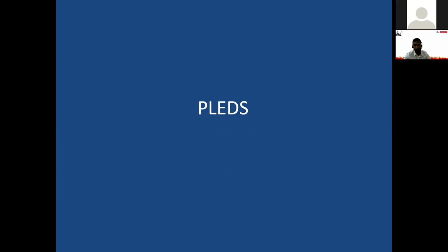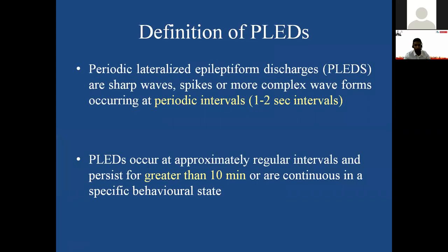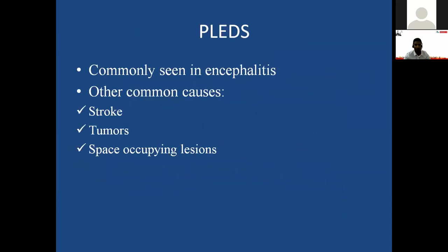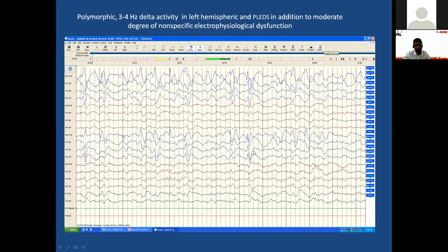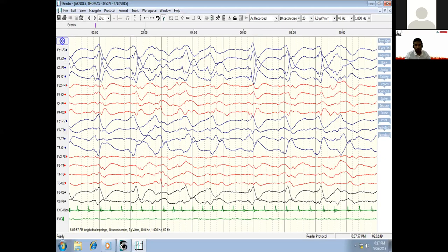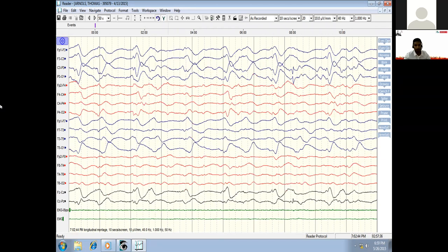PLEDs stands for Periodic Lateralized Epileptic Form Discharges. These are periodic discharges occurring at one-to-two second intervals, persisting for more than 10 minutes. PLEDs are common in encephalitis, strokes, tumors, and space-occupying lesions — typically restricted to one hemisphere. In this example, spike-and-wave discharges occur periodically, almost every second; if this continues for 10 minutes, it is called PLEDs. This other example shows PLEDs on the left hemisphere happening every second — lateralized to one side, in a particular area, and periodic.